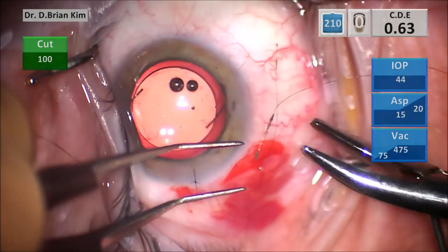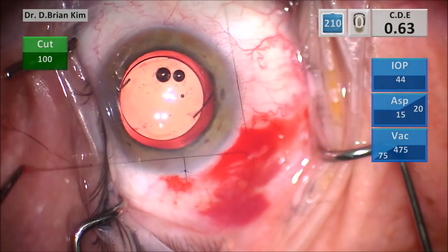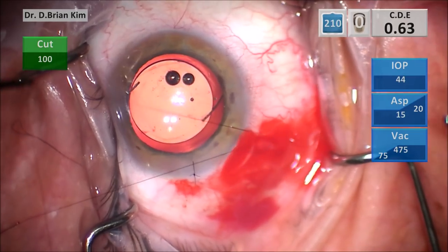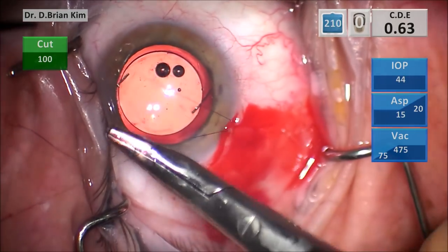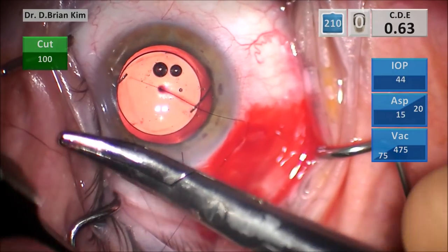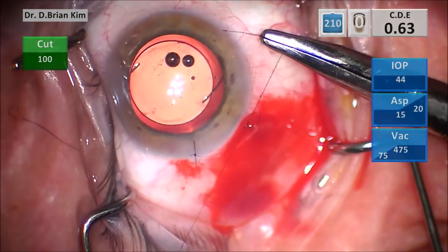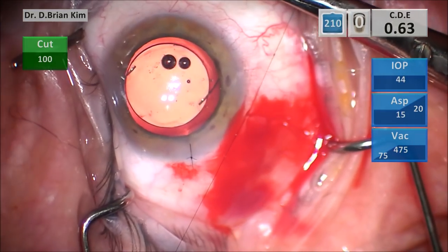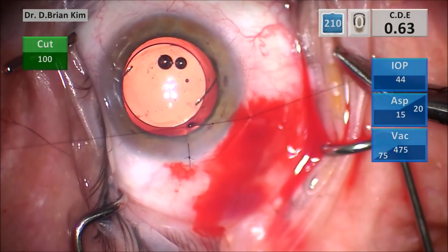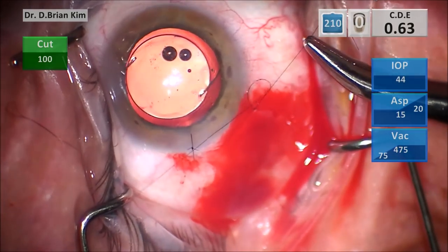And in this case, a three-piece lens in the ciliary sulcus is never a wrong choice. My capsulorhexis was a little bit on the big side, so I was not able to do an optic capture with this. I shot for one diopter less than plano, and thankfully this patient was 20/25 uncorrected post-op day one, so I chose one diopter less for a sulcus placement for this patient.